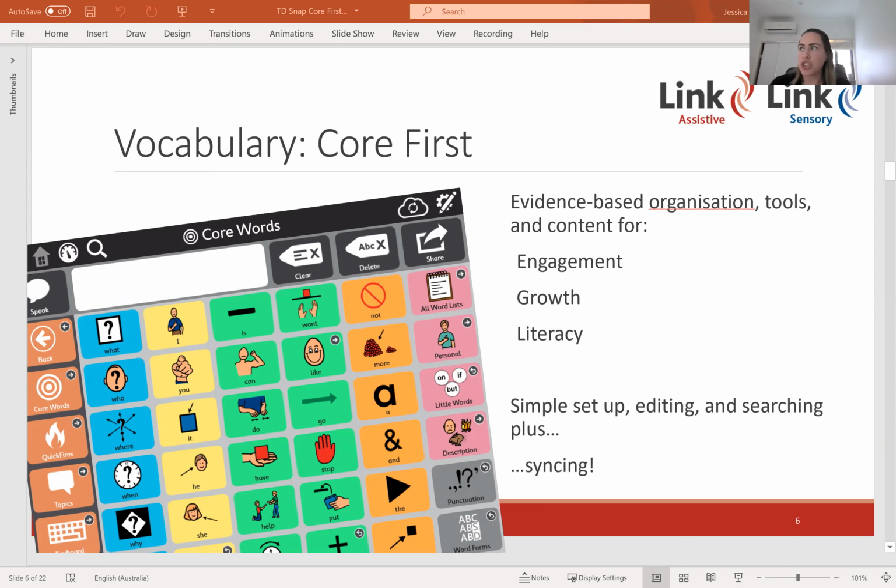If you want more detailed information about the background, evidence and features of core first itself, I'd encourage you to go back and watch the webinar presented by my colleague Amy Litton. That's up on our website, and she goes into depth about that, but I'll give you a super quick overview just in case you aren't familiar with core first. Tobii Dynavox has integrated the evidence base around organization of tools and content into core first.